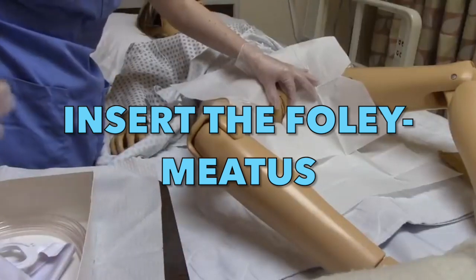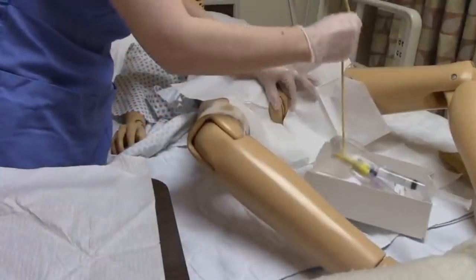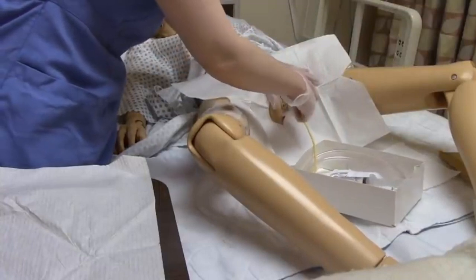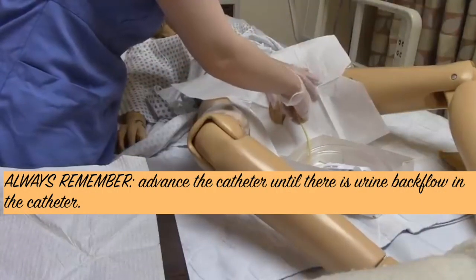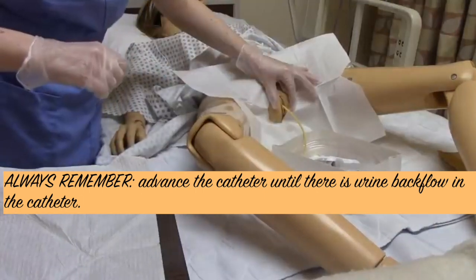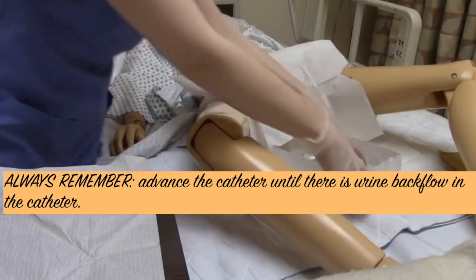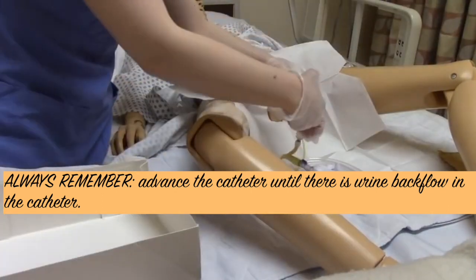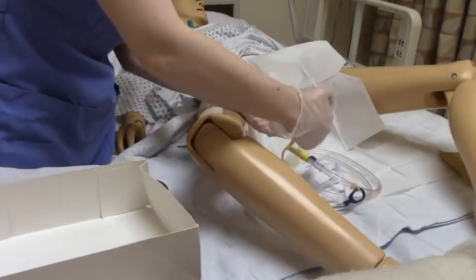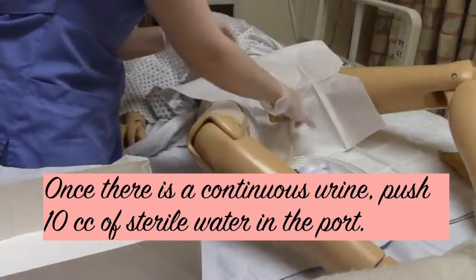Since we have already checked everything, we are prepared. Apply the lubricant gel, locate the meatus, and insert the foley catheter. Advance the catheter until there is a urine backflow seen in the catheter. When there is backflow, that is the time to push the 10cc sterile water in order to anchor and secure the balloon.